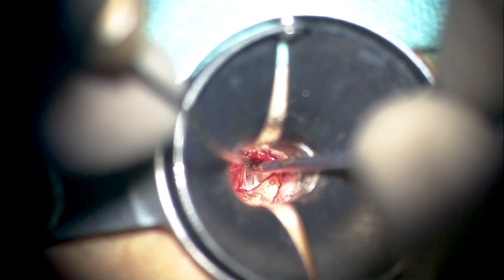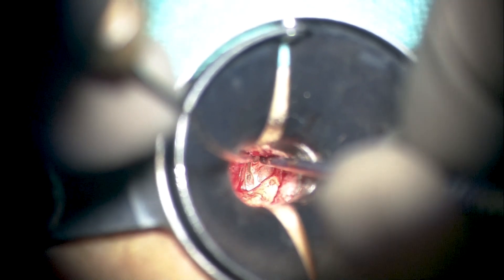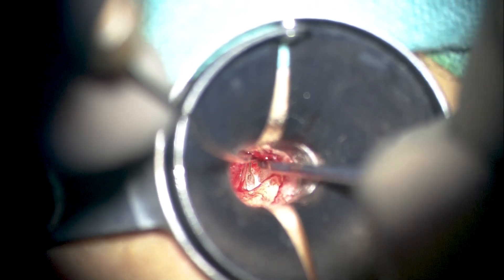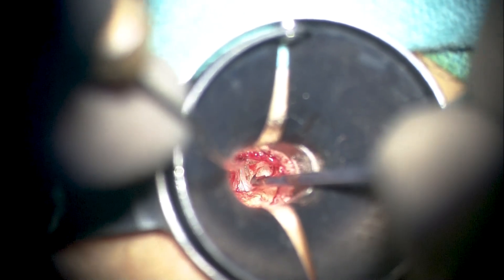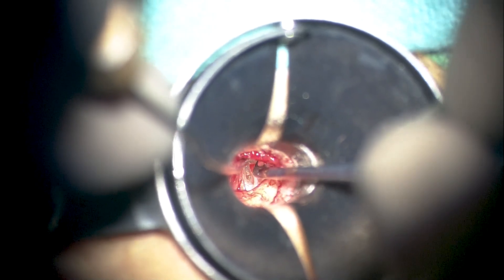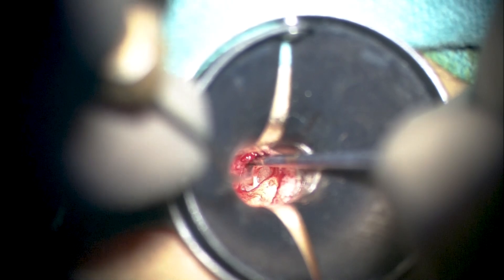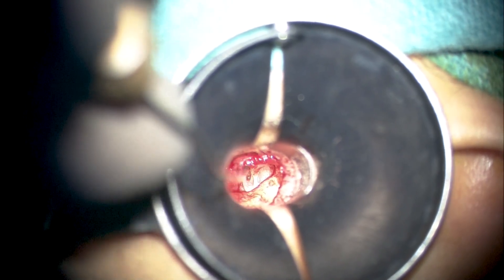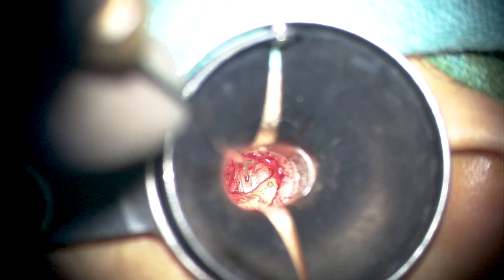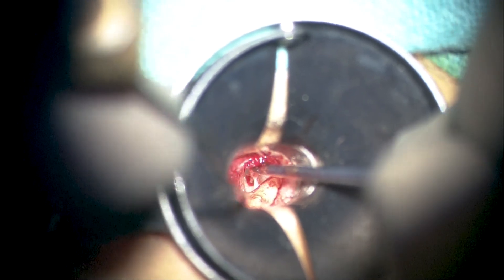We must bear in mind that our full-thickness cartilage graft will be resting on the lateral aspect of the long process of the incus, in contact with it. It is therefore very important to elevate the pocket or the pars tensa from the incus long process completely and not leave behind any remnants, because if that happens, you would end up with entrapped epithelium or cholesteatoma inside the middle ear with an opaque drum, greatly compounding our troubles.